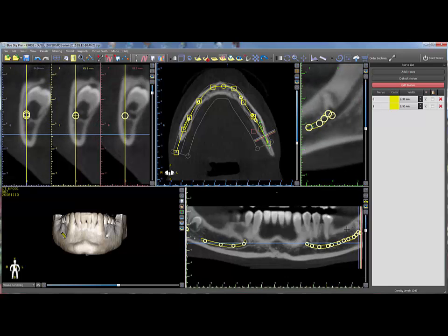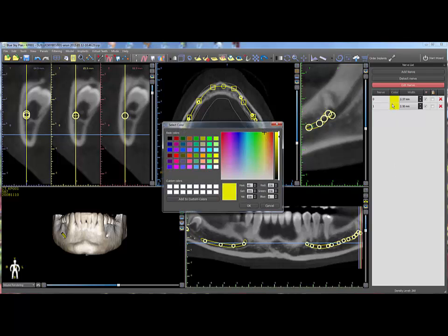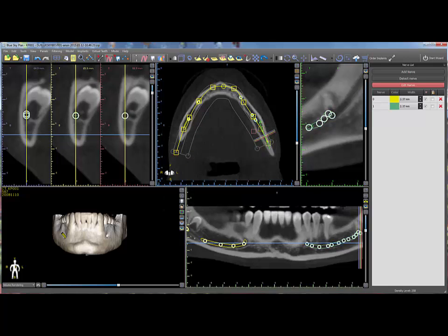Other modifications can be made directly from the nerve list. The nerve color can be changed by left clicking on the nerve's color in the nerve list, then selecting the desired color from the select color window and clicking OK. The nerve width can be changed by clicking on the up and down arrows in the width column, or by highlighting the value and editing it.